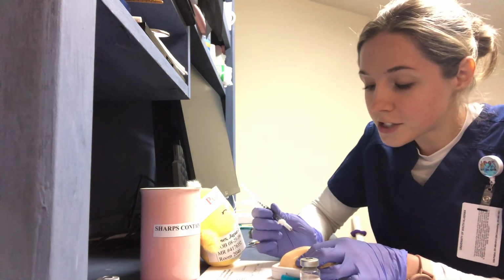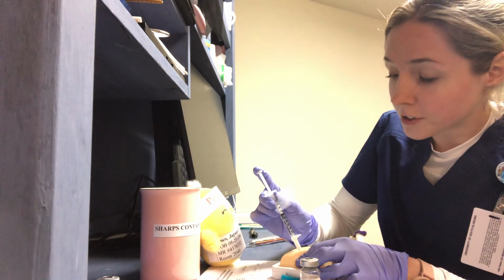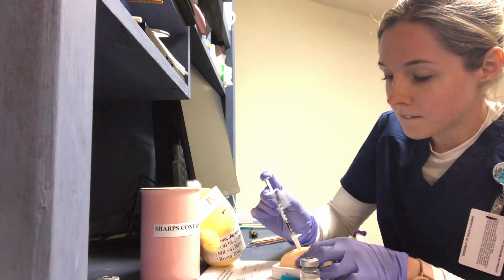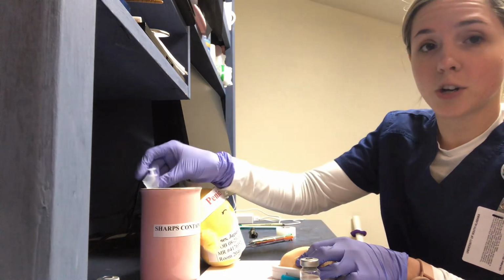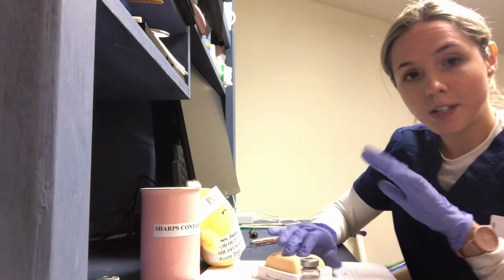We can pinch an inch here, so I'm going to go in at a 45-degree angle. Quickly insert, inject over 30 seconds for this heparin injection, keeping it pinched. And this needle will go immediately into the sharps. And our lid will go into the sharps. We're going to want to go ahead and cover that back up, release it.